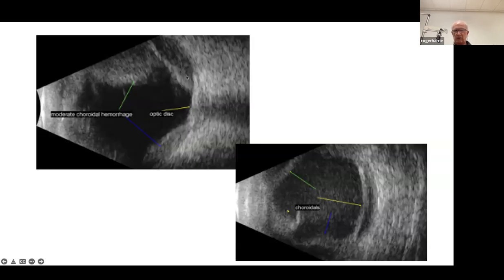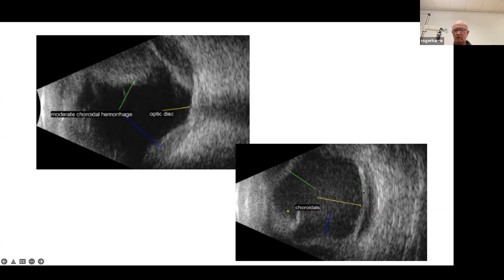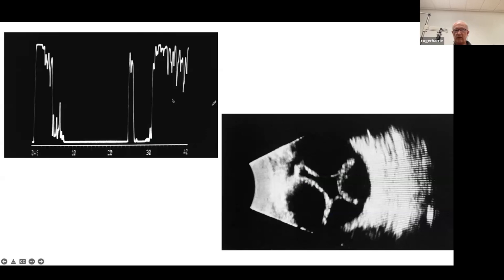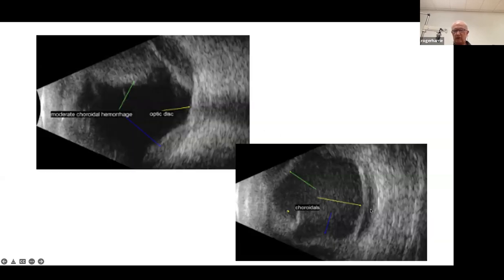Usually choroidals don't come right off the optic disc — look at the anatomy: the optic nerve comes into the eye and the choroid starts here, so it really can't extend right off the disc like the retina does. So if you see a shape like this, that's consistent with choroidals, with that scalloped appearance more peripherally but not directly off the disc. Here's another example: a low-lying choroidal that could be confused. The A-scan is helpful here — look for that double peak, and if you see it, that pretty much nails the choroidal detachment diagnosis.